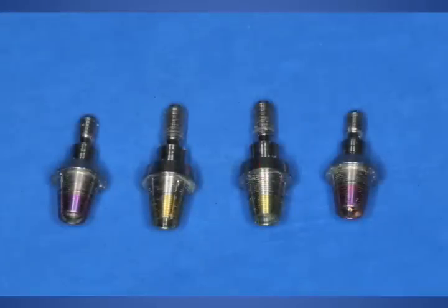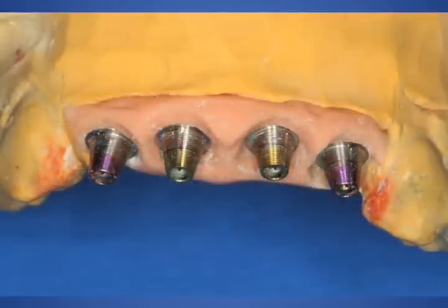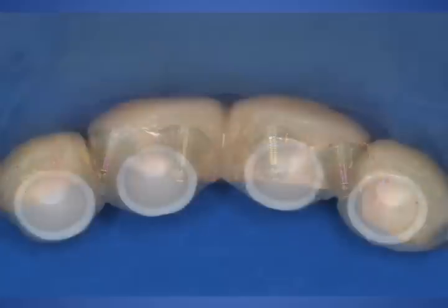We would use transitional abutments in this situation. You can see they're conical in shape, which would allow us to place our final transitional splinted crowns the day of surgery. So these are transitional Nobel Biocare abutments that, again, this is all done preoperatively by the dental laboratory. They are determining ideal position for ideal final aesthetics of the final crowns.